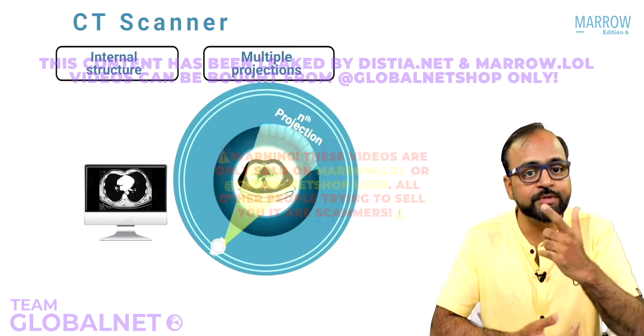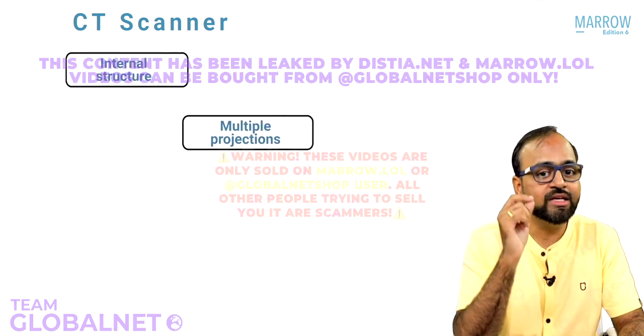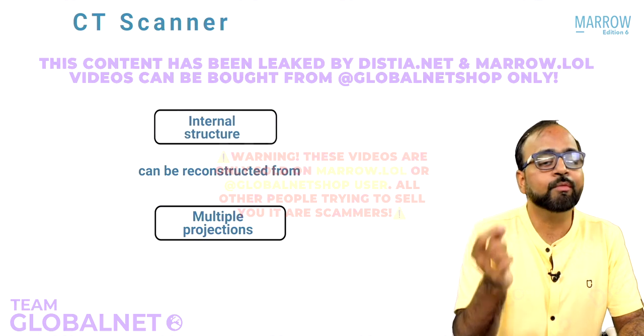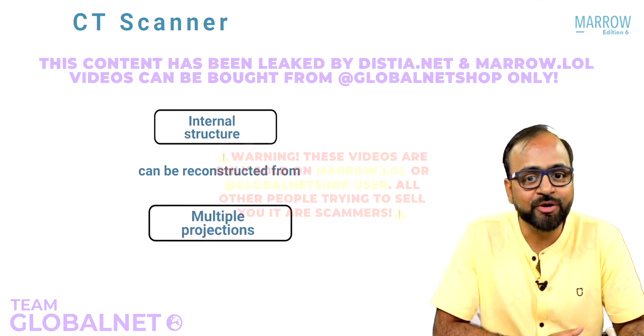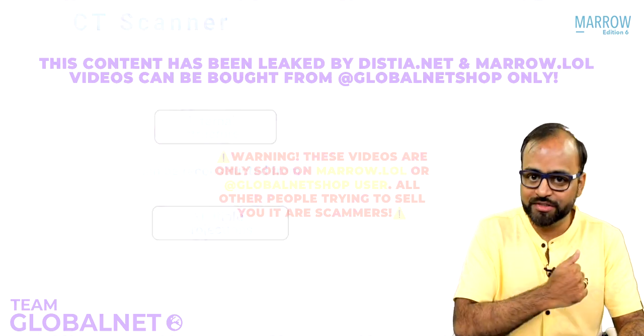So what is the basic principle of CT scan? Do you remember? The basic principle of CT scan is that the internal structure of an object can be reconstructed from multiple projections of that particular object. Now, does it make sense to you? Yes, this is how CT scan actually works.